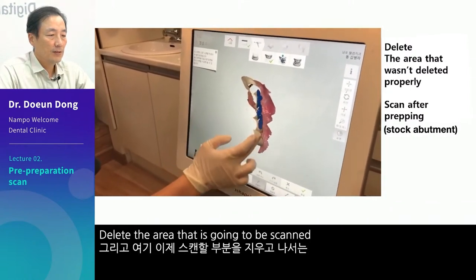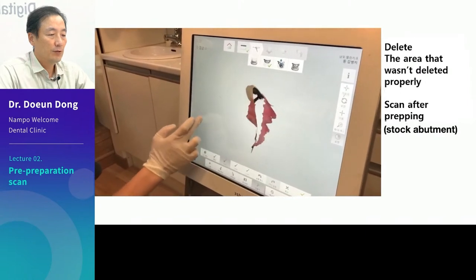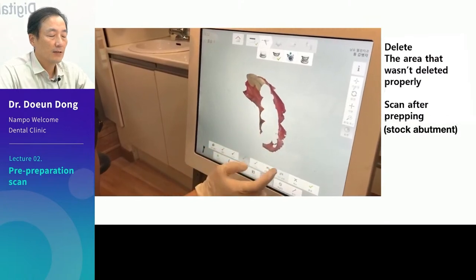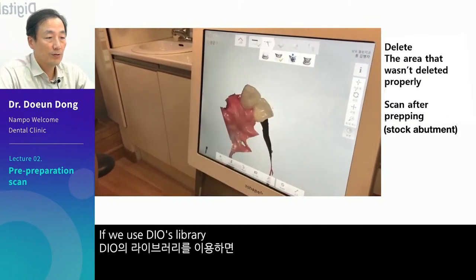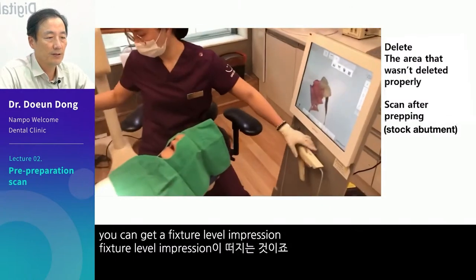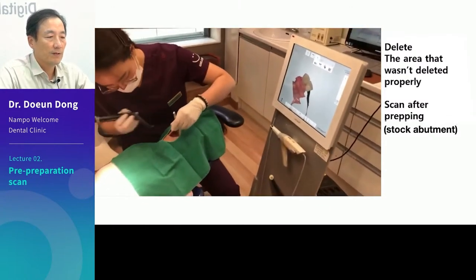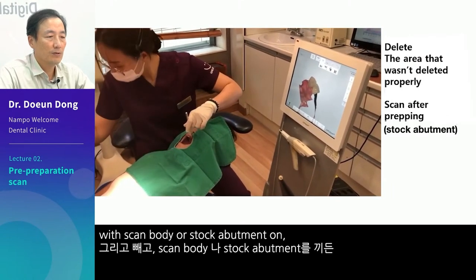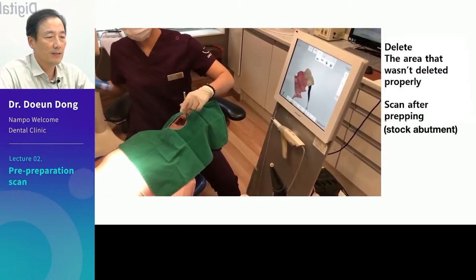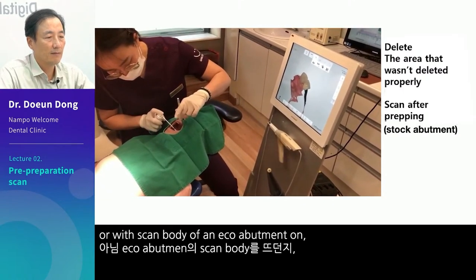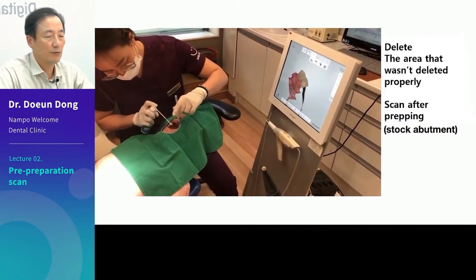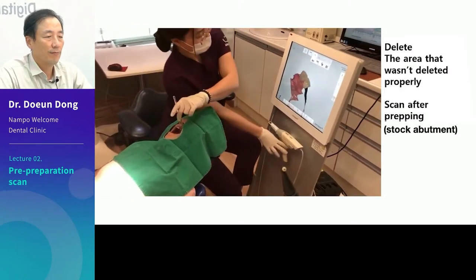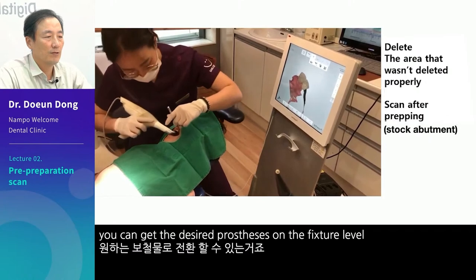Delete the area that is going to be scanned. Right now, the patient is wearing a stock abutment. Even with the stock abutment, if we use DIO's library, you can get a fixture-level impression. PMMA on or off, with scan body or stock abutment on, or with scan body of an eco-abutment on — whatever is on or off, with the pre-prep scan, you can get the desired prosthesis on the fixture-level.